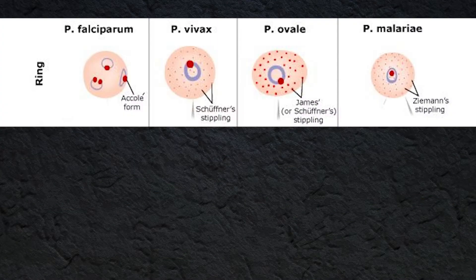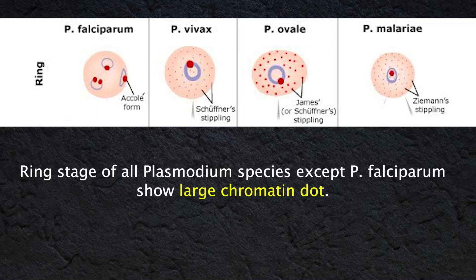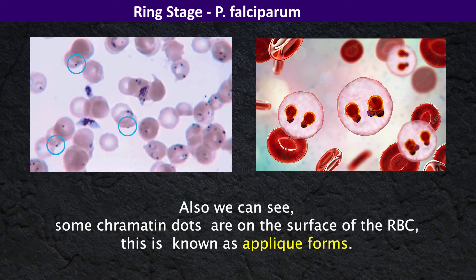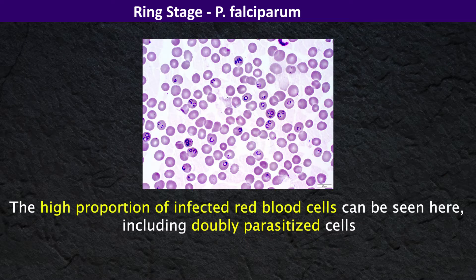Ring stages of all Plasmodium species except Plasmodium falciparum show a large chromatin dot. Plasmodium falciparum, on the contrary, has one to two small chromatin dots. Also, we can see some chromatin dots on the surface of the red blood cells — this is known as appliqué forms. The high proportion of infected red blood cells including double-parasitized cells is characteristic of Plasmodium falciparum.